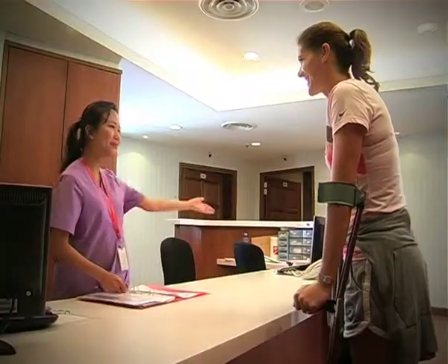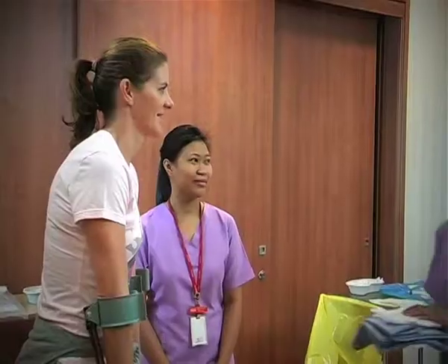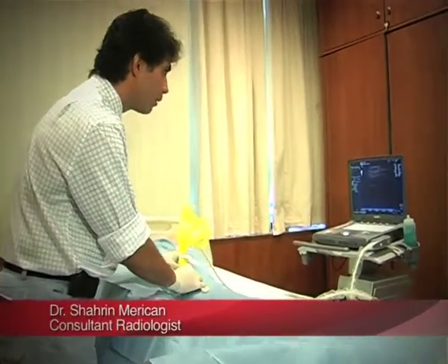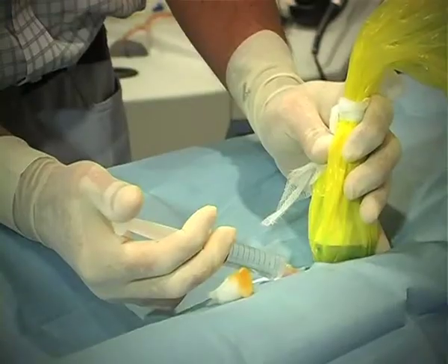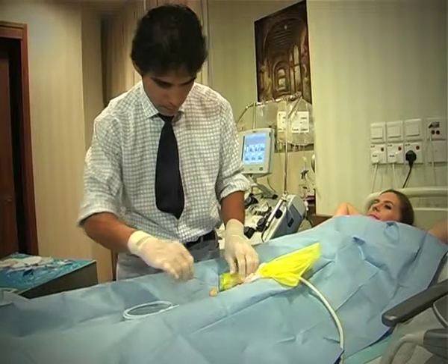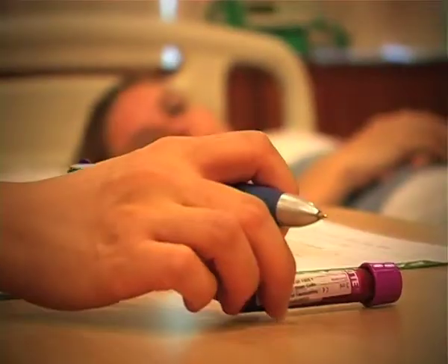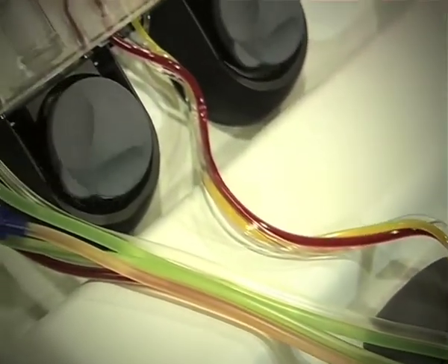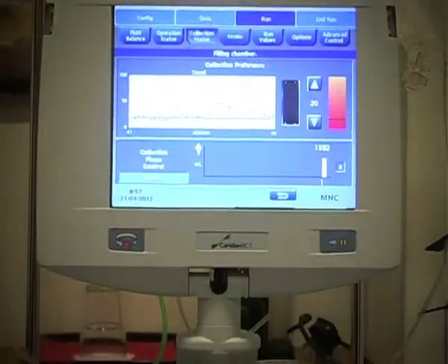On the day of the stem cell harvesting, you'll be required to take 2 calcium tablets with your breakfast. A gown will be provided upon admission. A doctor will utilize an ultrasound machine to locate your femoral vein at the groin area, and local anesthesia is then administered. The apheresis catheter is then inserted into the femoral vein. Once the catheter is inserted, your blood sample is taken to determine the number of white cell counts. This double lumen catheter will allow blood to flow from the femoral vein into a blood cell separator.